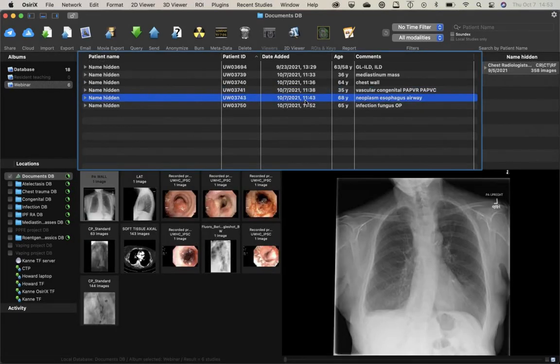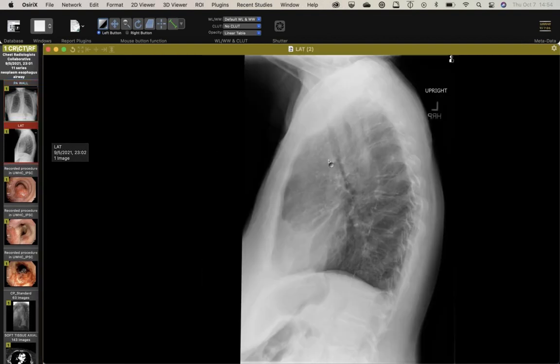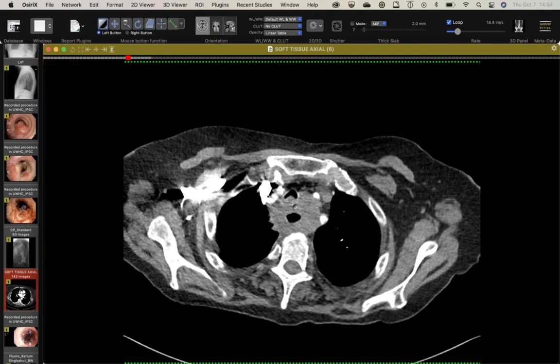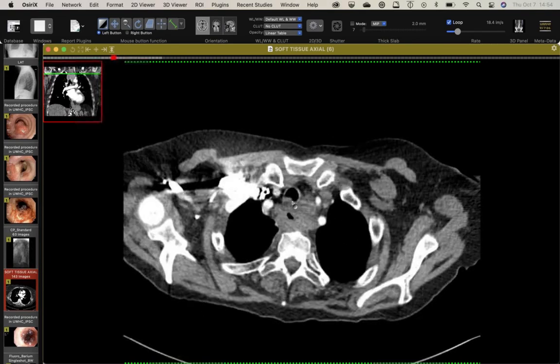This is kind of an impressive case. It just got a nice imaging. So this patient presented with hemoptysis, and you can see the upper mediastinum is very abnormal. There's an effusion. If you go to the lateral, clearly there's something bad going on here behind the air column. So it looks like an esophageal type mass there. So they did a CT scan and we have this really ugly looking esophageal mass. And you notice there's indentation and irregularity of the tracheal lumen right about that level there.